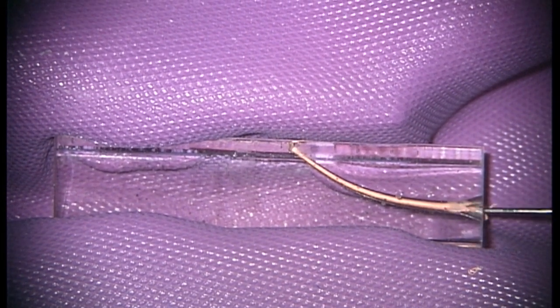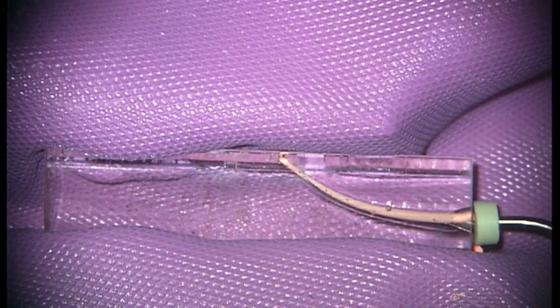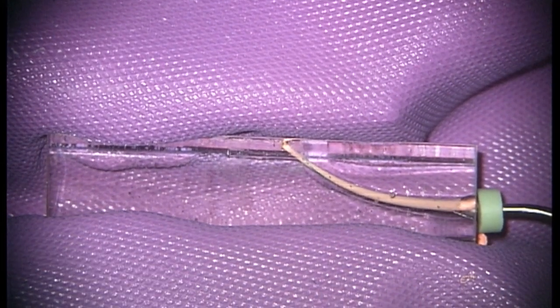In this clip we're not applying any sealer, to see easily where the GP is extruded to. We now go for the down pack having removed the excess GP. The movement is one continuous wave of condensation, applying heat as we do so, and as you can see at this high magnification, we've generated a good warm condensation of the guttapercha right towards the apical third. We then apply a little heat, a twist, and remove the plugger in one gentle movement, and immediately go back in with the Buchanan hand plugger to apply vertical compaction to the GP cone.